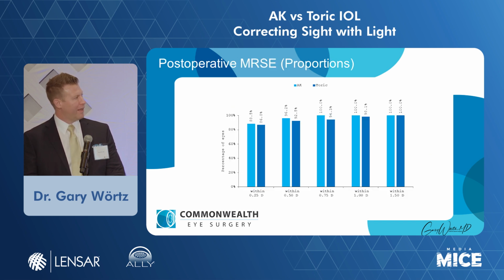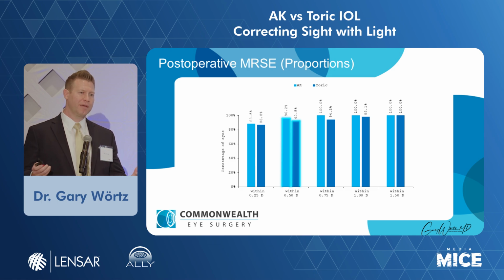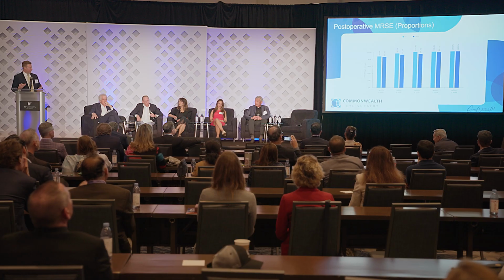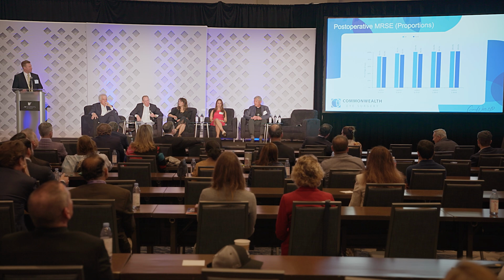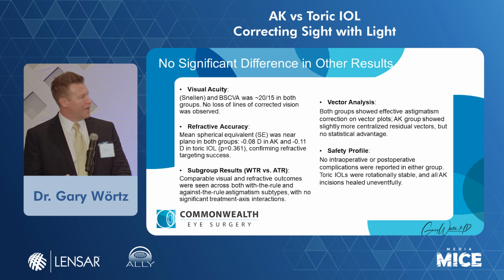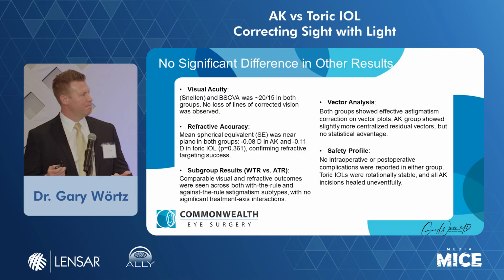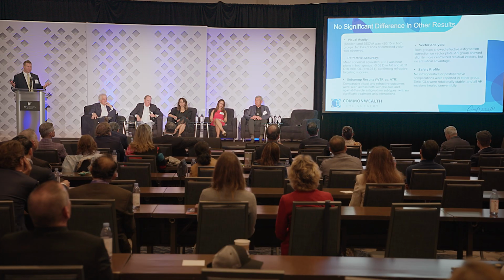When you look at the manifest refraction spherical equivalent, we were at over 92% within a half diopter. So not only with this treatment are we getting good coupling of the AKs, we're not getting any weirdness with the refraction results. We're getting excellent refractive results. It's not just astigmatism control. And when you look at every other factor that we looked at, whether it was best corrected visual acuity, between both groups they were right around 20/15. There were no losses of visual acuity.